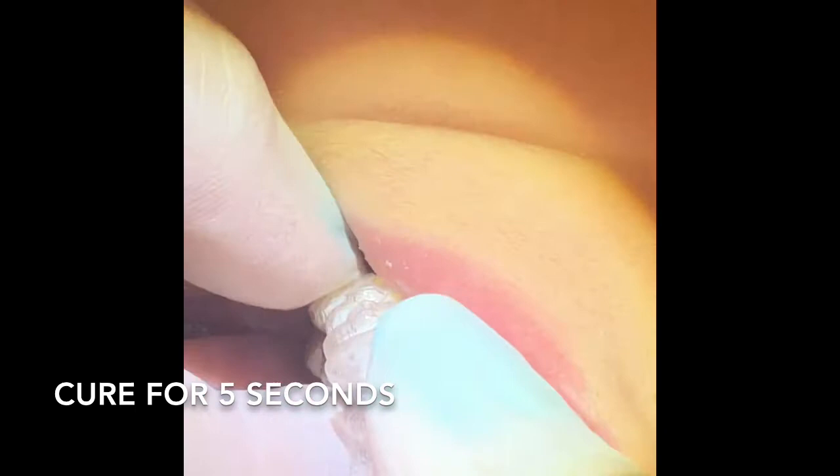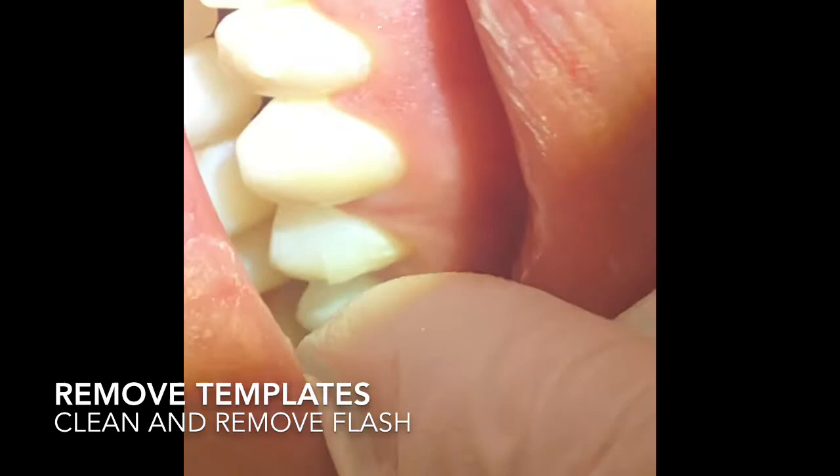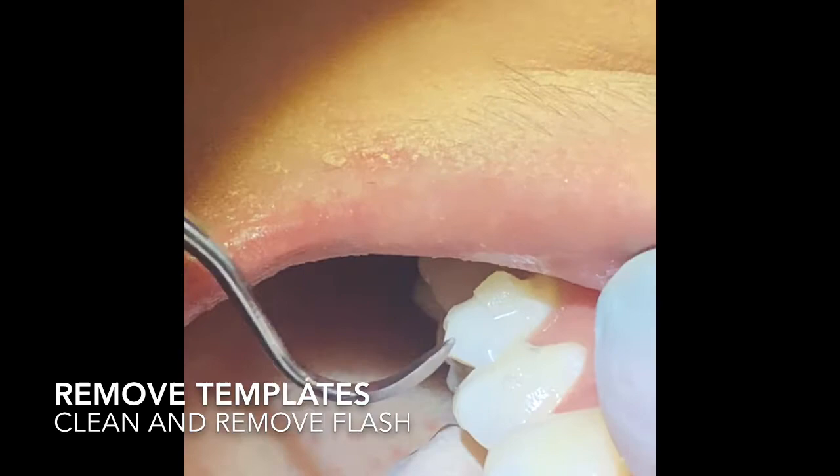Perfection! You can see all the attachments - still got to clean up a little bit of extra flash. To clean the flash off, I just use a scaler. I start at the occlusal - one single scaler move takes the occlusal off, and then I just go around to remove the rest.